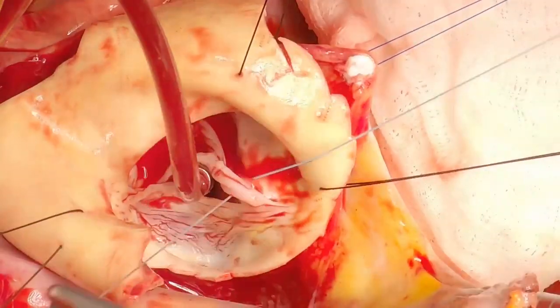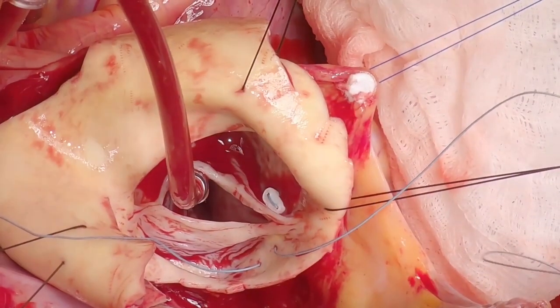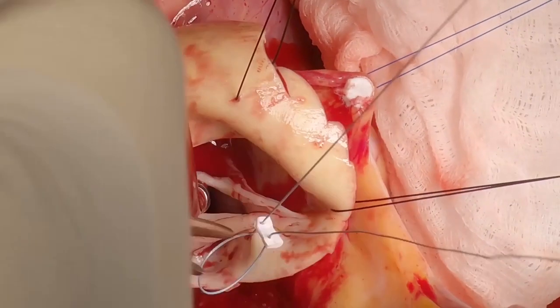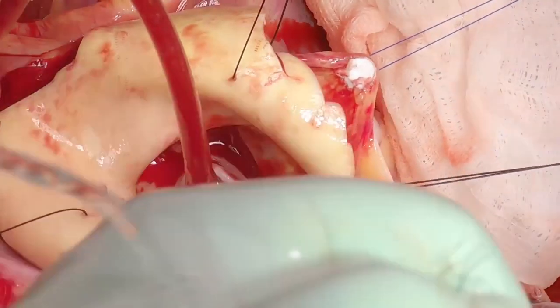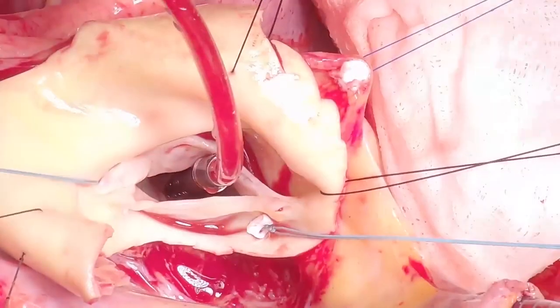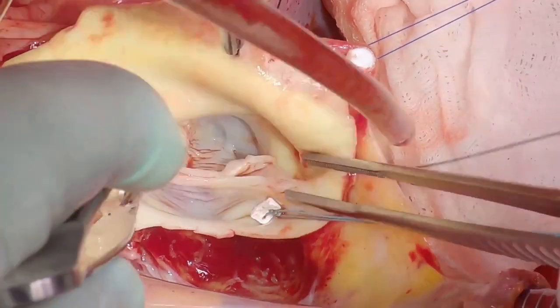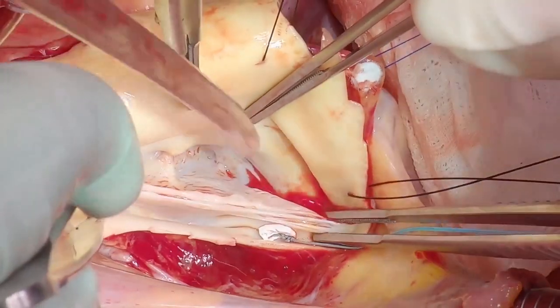The next step is to put in the Cabrol sutures to improve the inter-commissural angle — to narrow that down and improve apposition of the leaflets. Put the Cabrol sutures more into the aortic tissue, not too close to the annulus. Tie those into position. There's a small fenestration at that commissure, but that won't be a problem once you narrow the inter-commissural angle. You can now begin to work on symmetry of the two leaflets — there's a bit of potential prolapse in the middle of the conjoint leaflet.